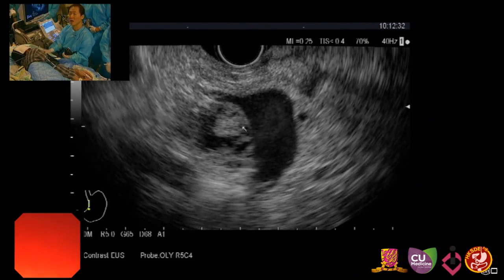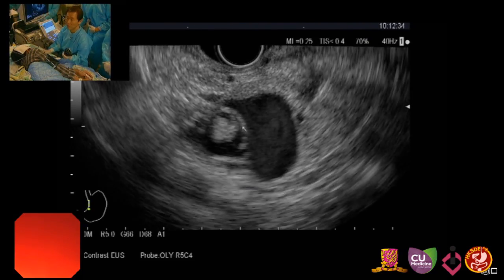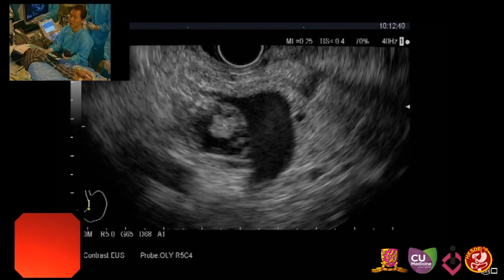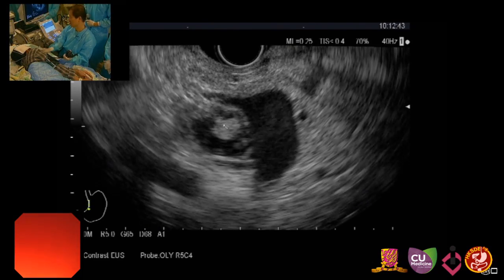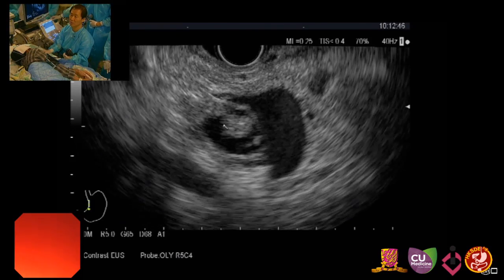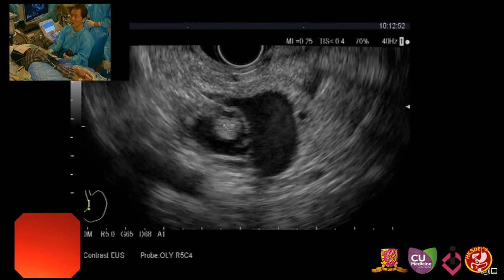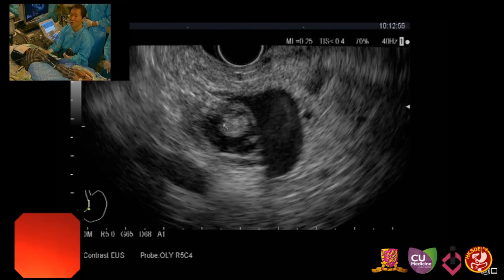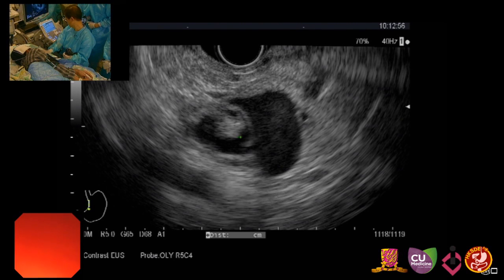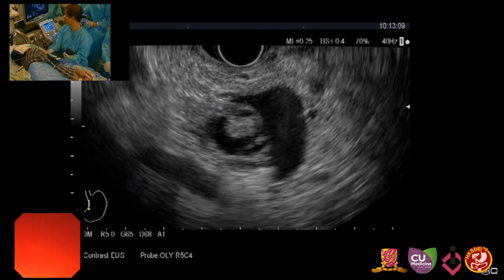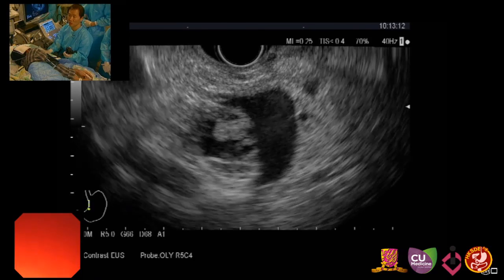Sometimes this kind of lesion can be caused by a mucin plug. For differential diagnosis, contrast-enhanced EUS is a very powerful tool. A mucin plug does not show any vascularity after contrast injection, but a mural nodule can show vascular enhancement after contrast injection. I'm going to use contrast for this case to differentiate these findings. The mural nodule here measures about 6.7mm in diameter — again, a rather large mural nodule.